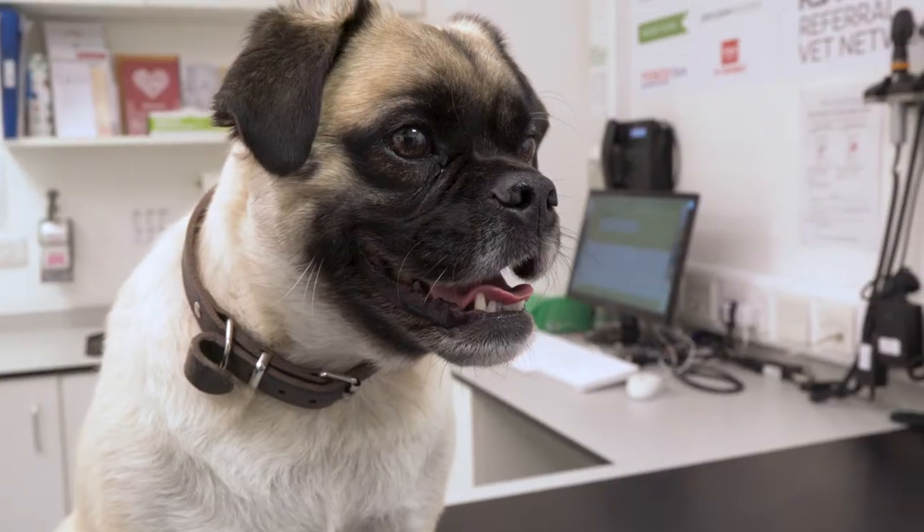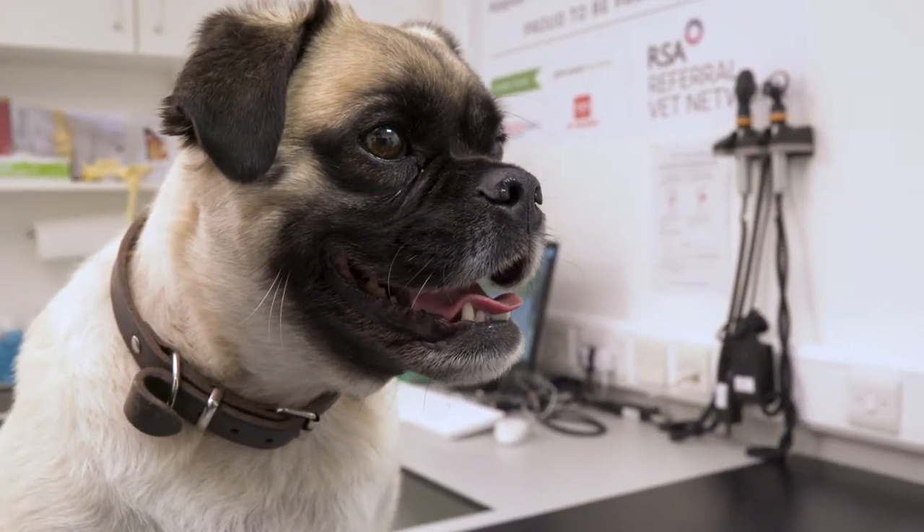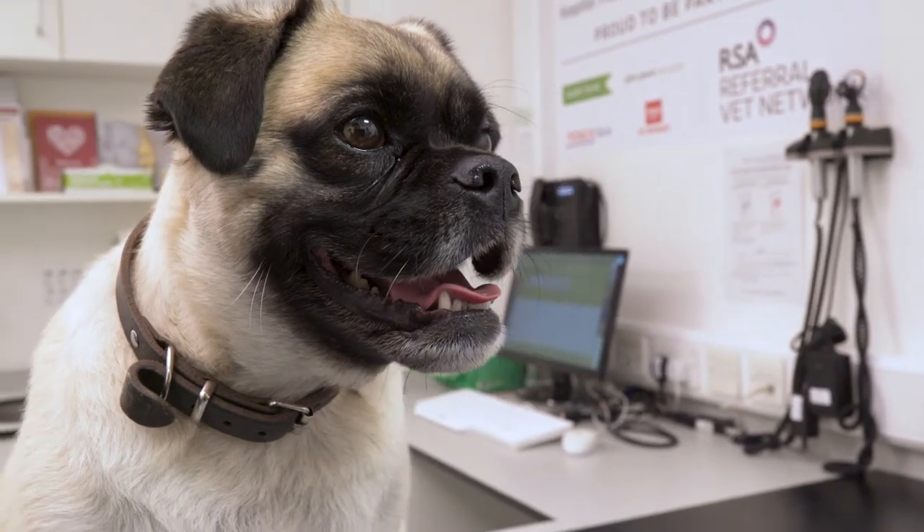This how-to video was designed to recap what you've been taught by your vet with regards to injecting your pet. If you have any concerns about the injection technique then you should see your vet.